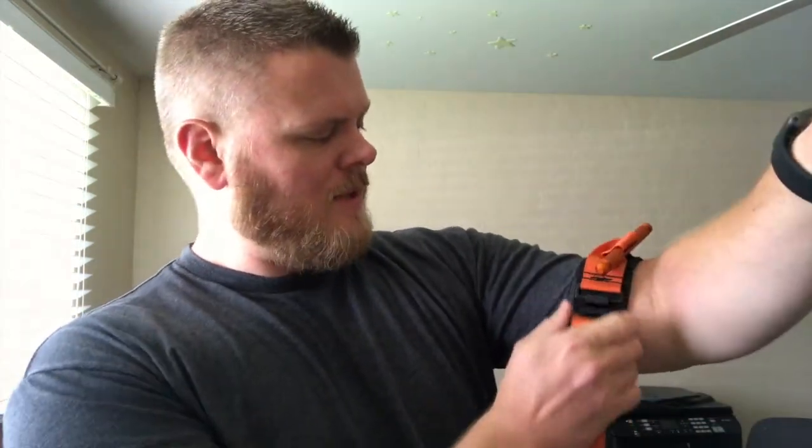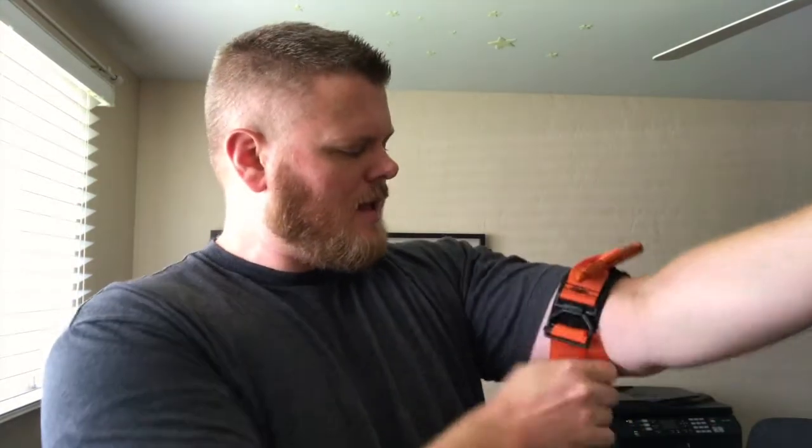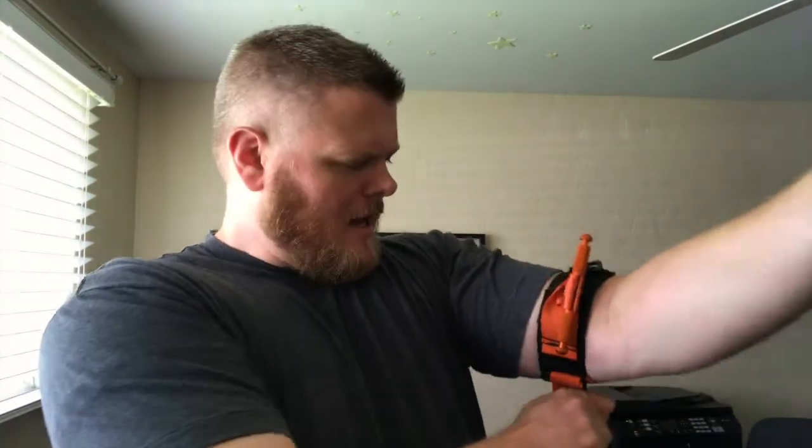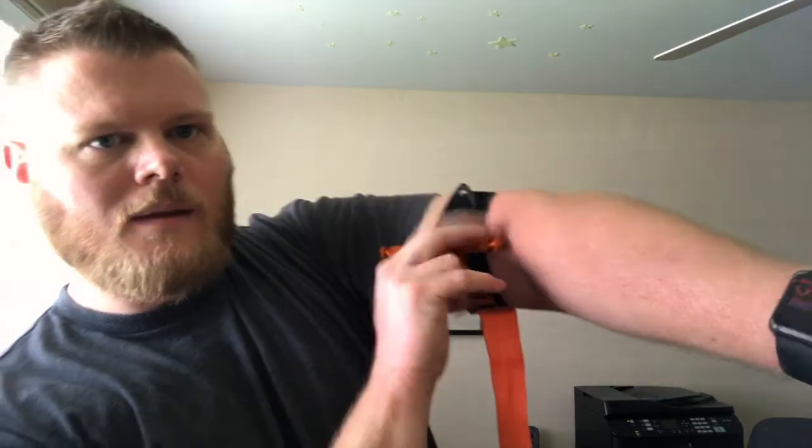Just a quick demonstration with the Soft-T — I'll show you here on my heart rate monitor, which has me at about 90-91 beats per minute. I take this loop, apply it, pull it nice and tight, and start twisting to apply pressure. The main thing is to stop the blood flow. And there it is — it's completely lost my heart rate, as you can see. You wouldn't want to keep that on too long, which is why tourniquets include a place to write the time they were applied. But it's that fast. Having one of these is definitely a life-saving device.